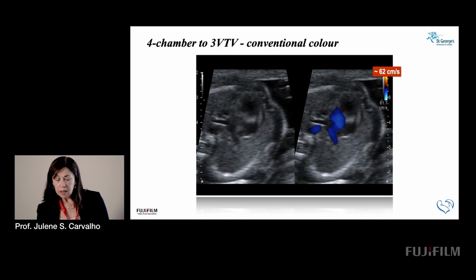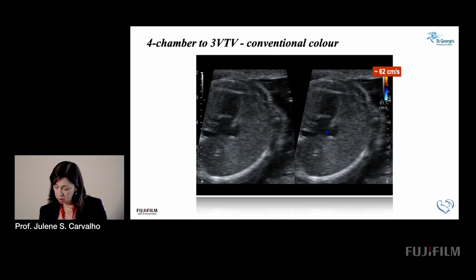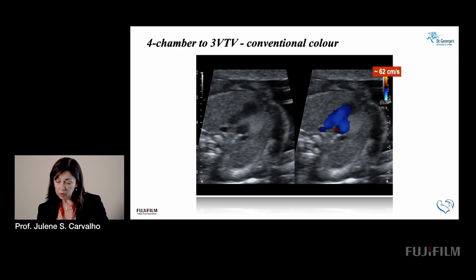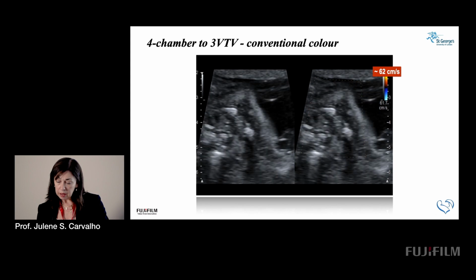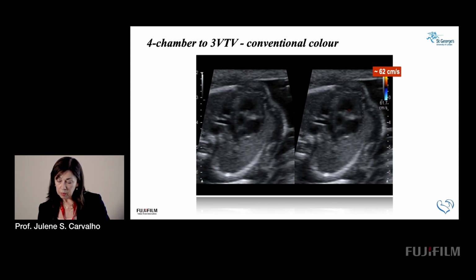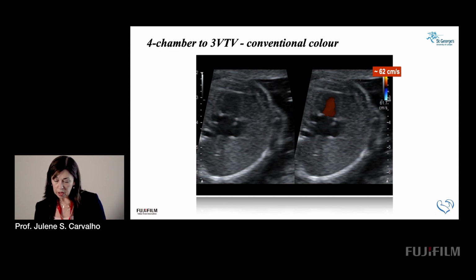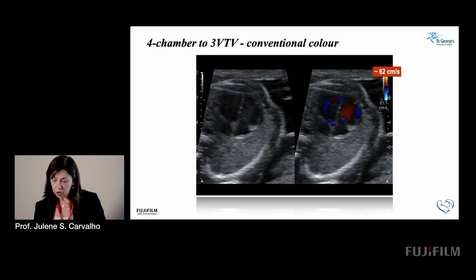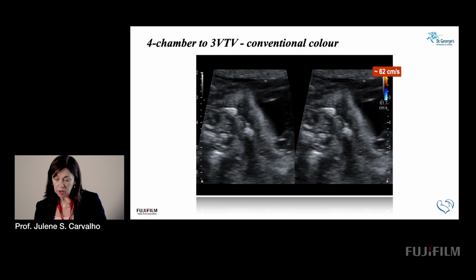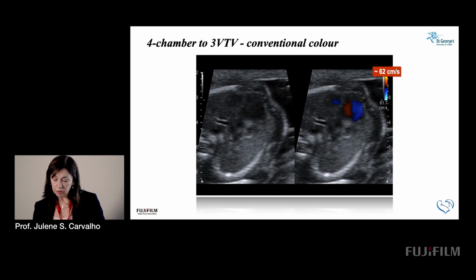On a higher scale, which is what you should be using if you're looking at the main vessels and the intracardiac flow through the tricuspid and mitral valves, you get a laminar flow. And you can see here in this example that using 62, you can also see very briefly a little bit of aliasing there, which is telling you there is a bit of tricuspid regurgitation, which in this case is very physiological. There is no increase in the cavities, but you can just see that very briefly.